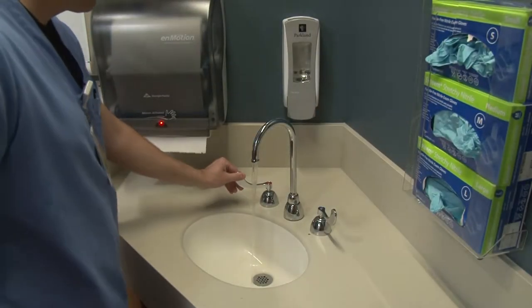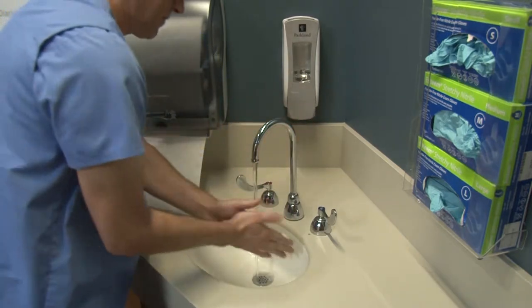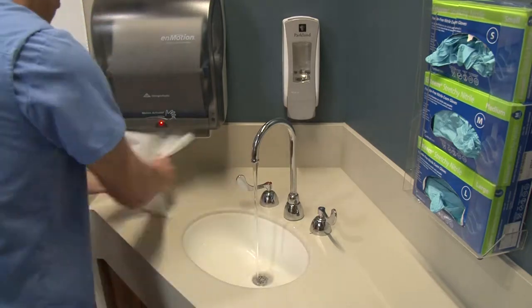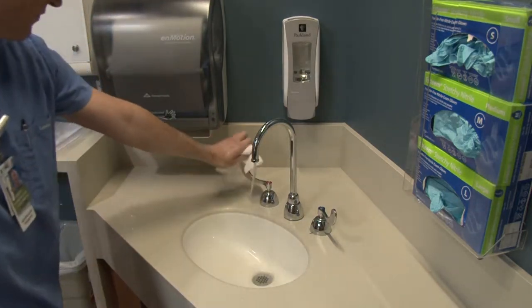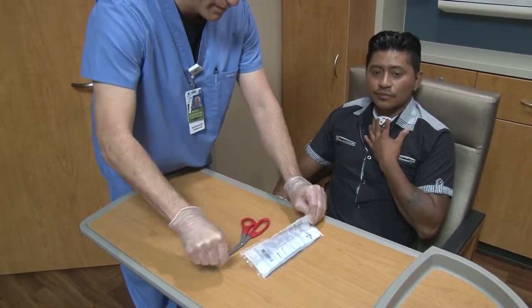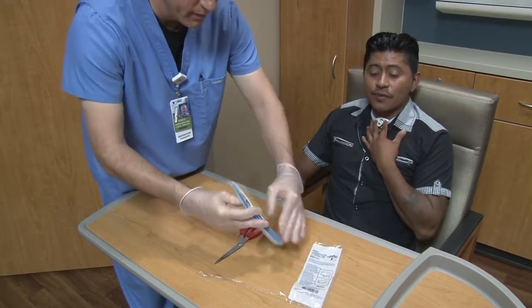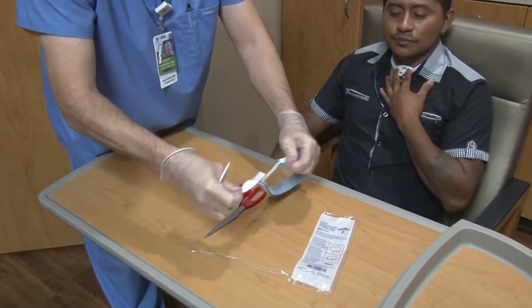Wash your hands. Take the new trach tube neckband from the package. The neckband has two parts. Separate the long and the short end of the neckband and put them on the table to use later.